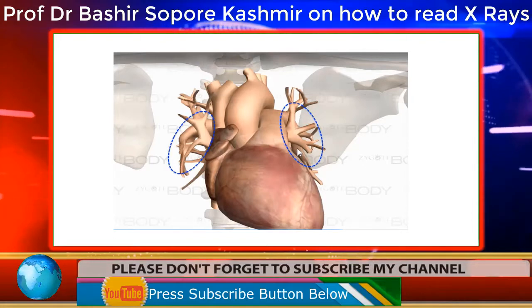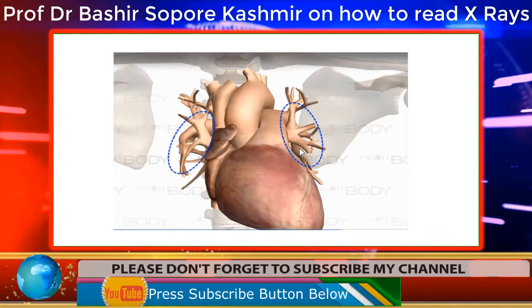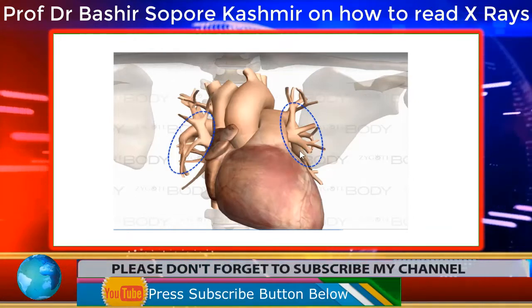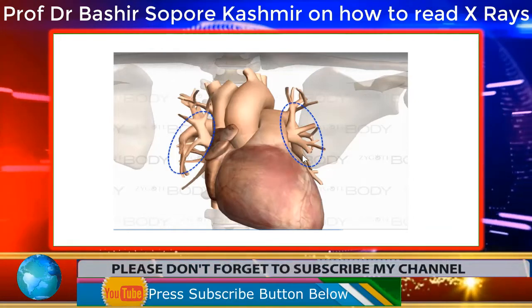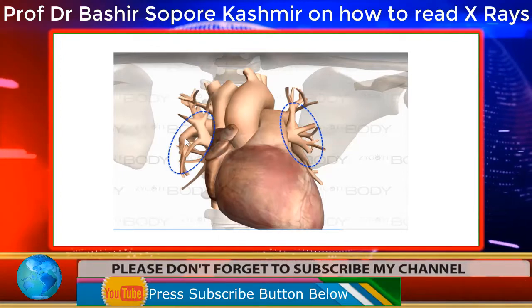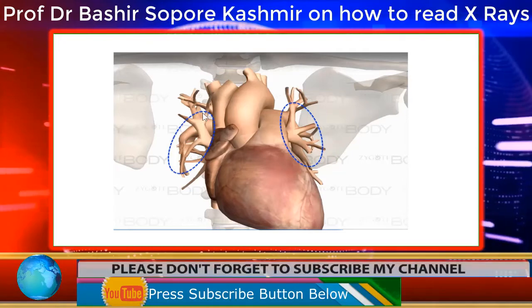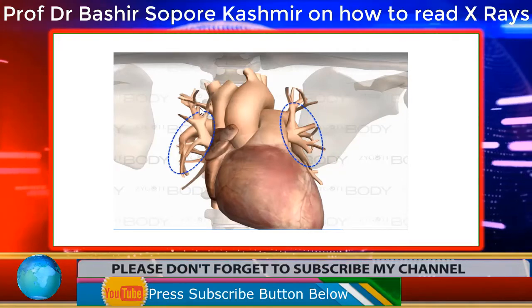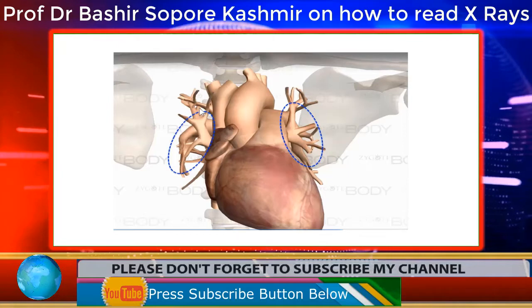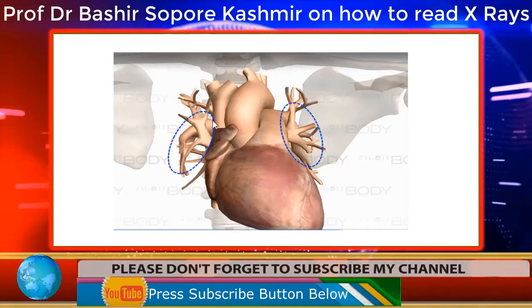And you see here this one. This is the left lower pulmonary artery. And this is the right lower pulmonary artery. And this is left upper pulmonary artery. These are the branches of main pulmonary artery.